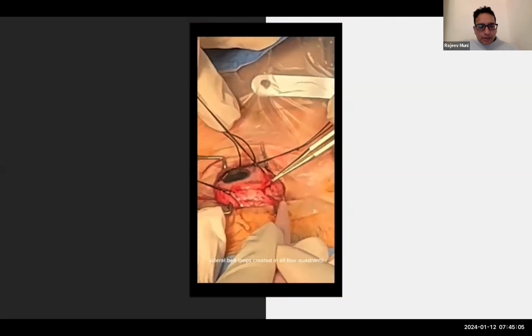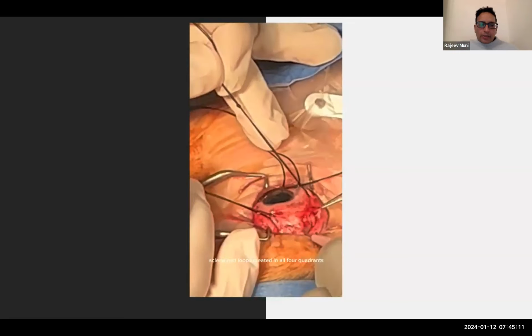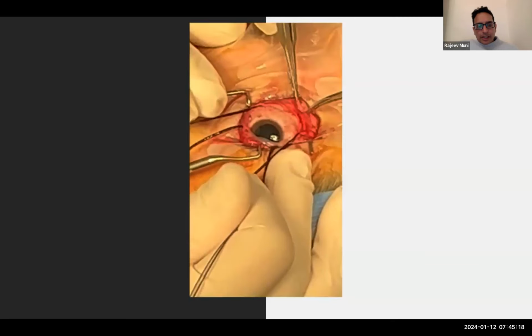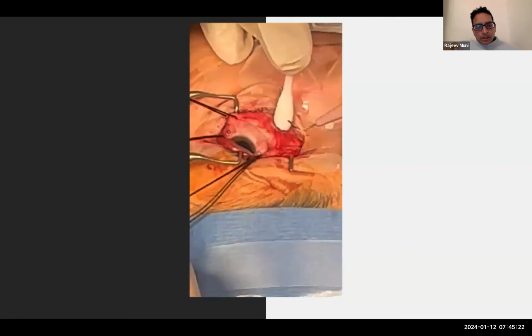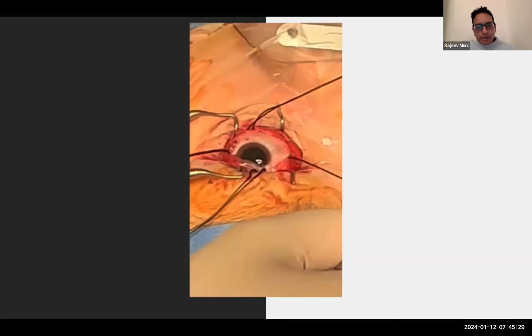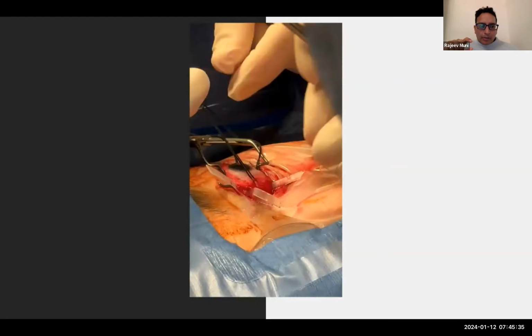So then we marked the break on the conjunctiva, and then we treated the break with cryopexy. And then it's not easy to see in this video, but essentially, instead of opening the conjunctiva, we just made 4 small radial conjunctival openings in the location where we wanted to put the belt loops. And we created the 4 belt loops in those small conjunctival openings.